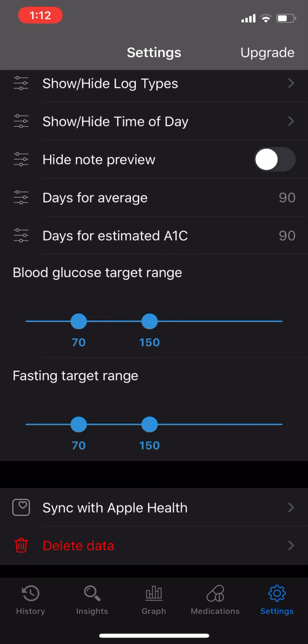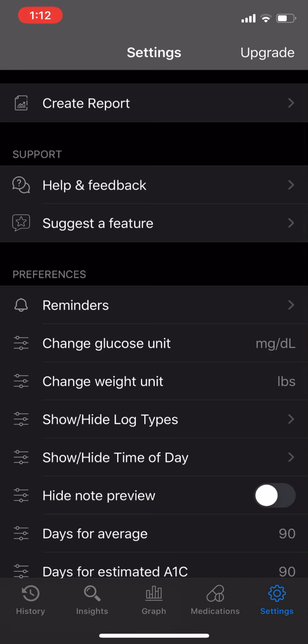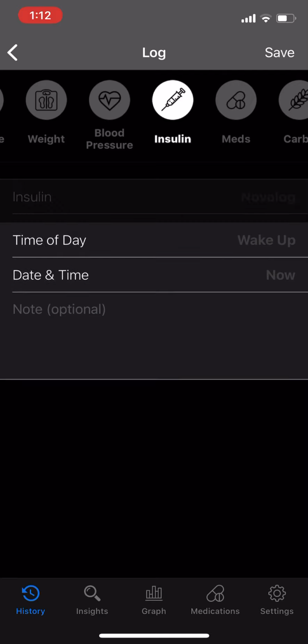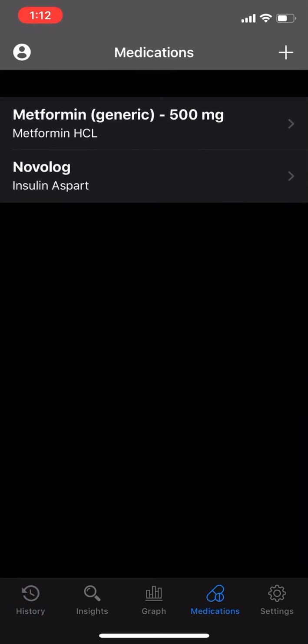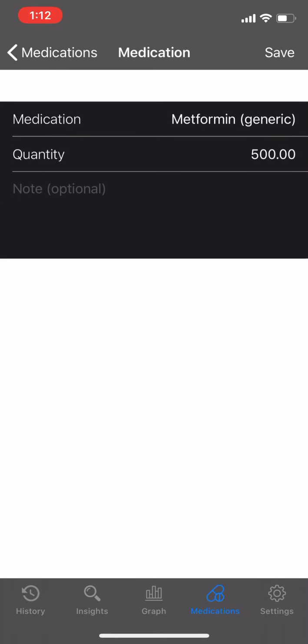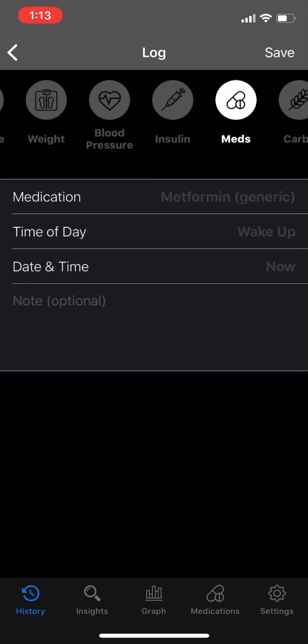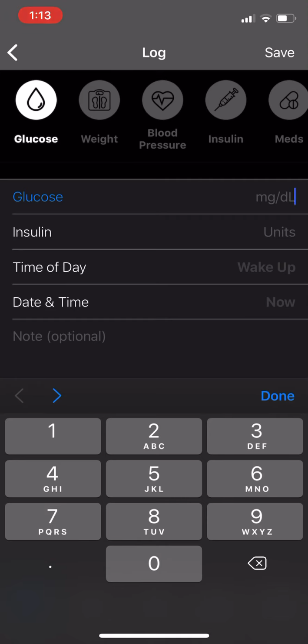User experience, overall, there were some parts that confused me, like trying to enter the medications and insulin there. That was one of them. Yeah, the quantity as well, that also confused me. But overall, once you have all that information figured out, as far as entering the actual data in, I feel like it seems pretty easy. So I'll give that a 4 overall. It was just okay.